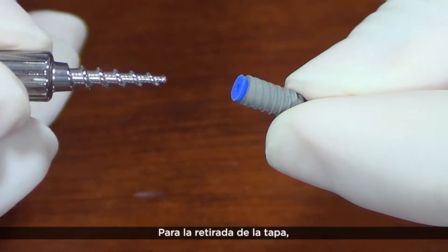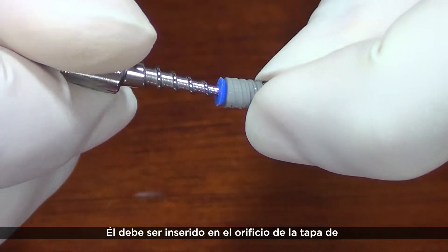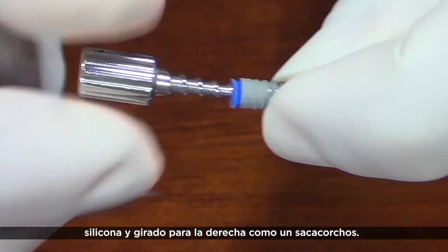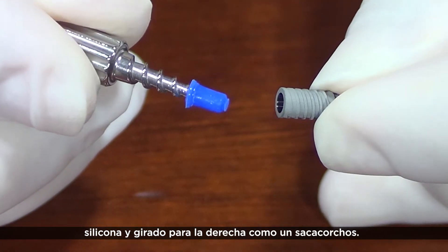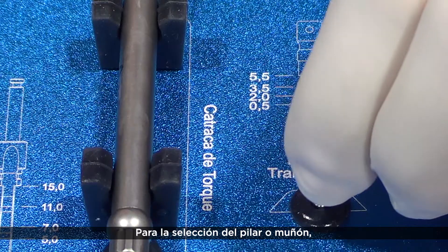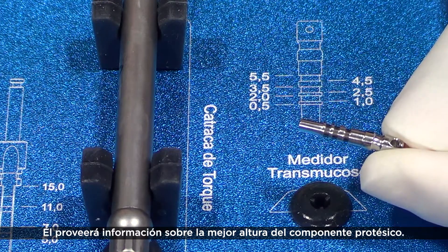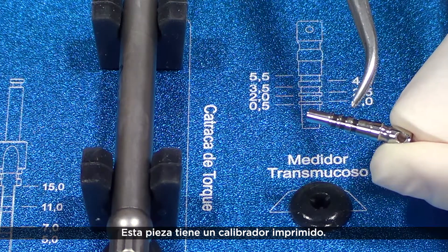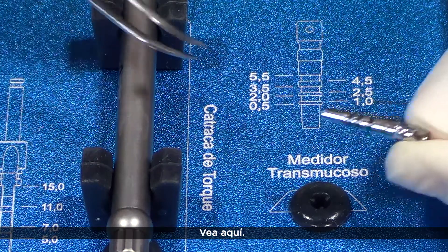For cover removal, use the proper manual extractor developed for this purpose. It must be inserted into the silicone hole and turned to the right, like a corkscrew. For abutment selection, the transmucosal measuring tool can aid you — it will provide information about the better prosthetic component head. This piece has a template printed at the case lid. Find it here.